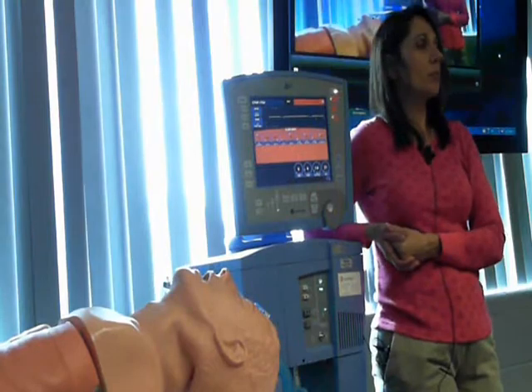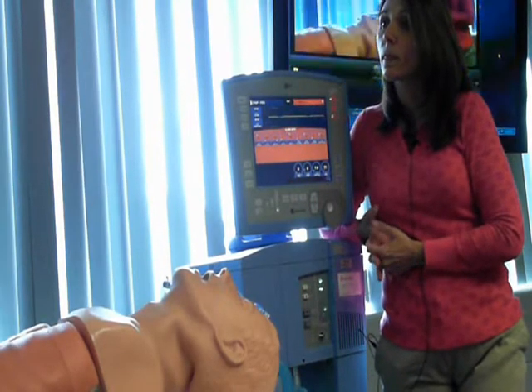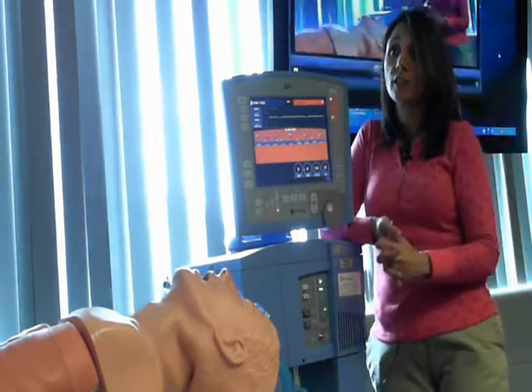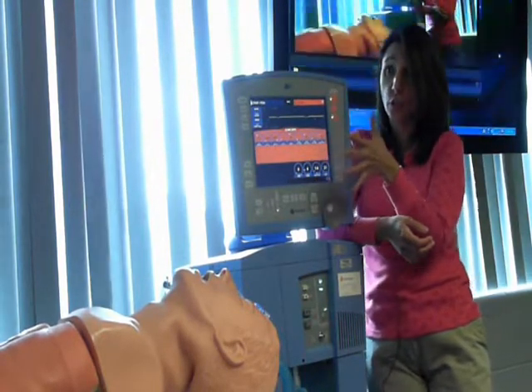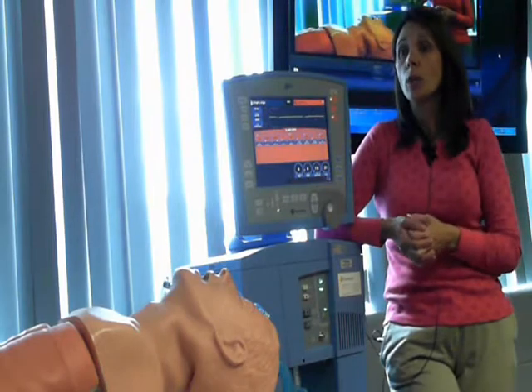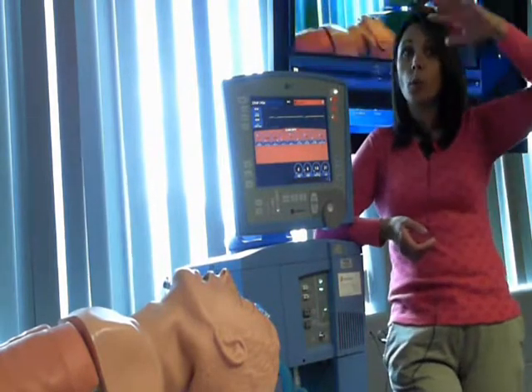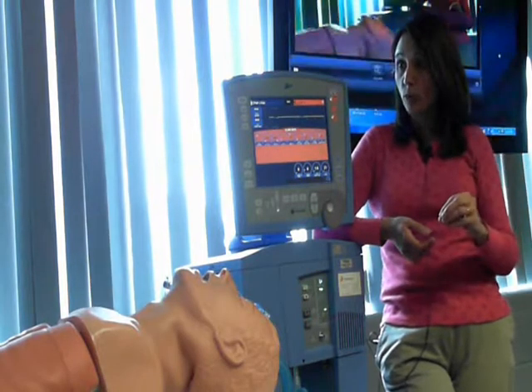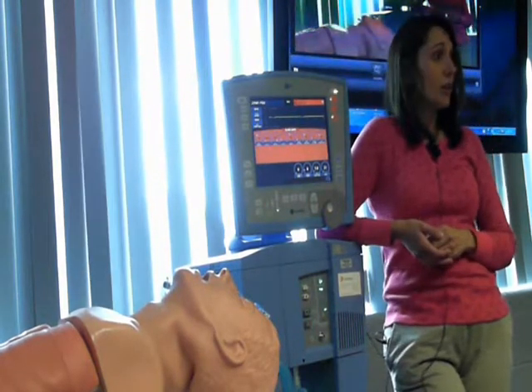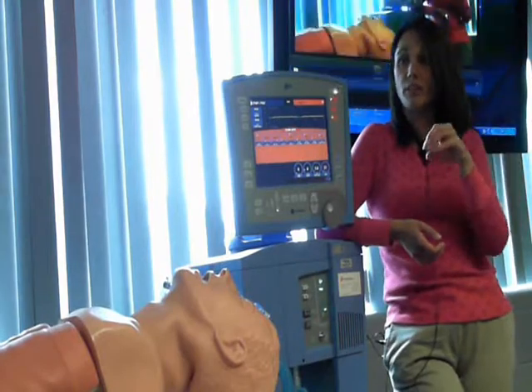Other questions? You guys have some really good questions so far. Yes. Are we allowed to change the settings on the ventilator without a physician's order or talking to you all? The technical answer is none of us are allowed to change vent settings without a physician's order. However, what you see in healthcare quite frequently, and it is perfectly legal and perfectly normal, is most physicians will allow the therapist to work off of a protocol. You guys are familiar with protocols? So there will be multiple ventilator changes without having the physician at the bedside for all of them. In some places, nursing will be responsible for some vent changes. It's going to depend on the facility.